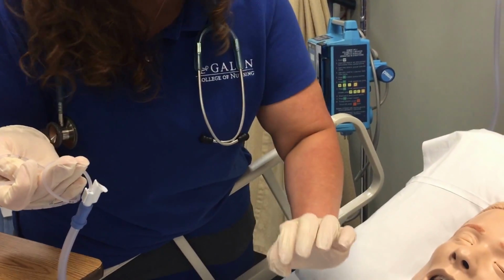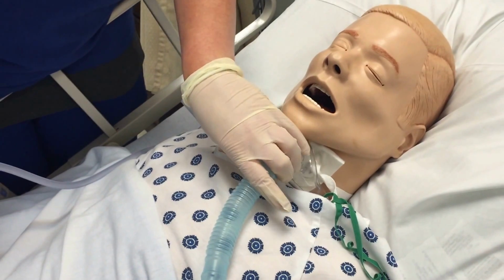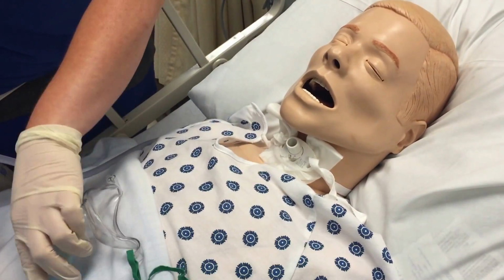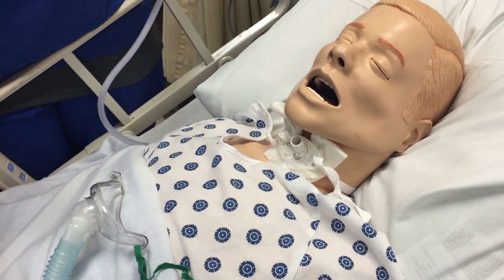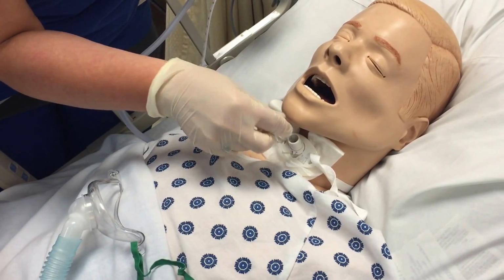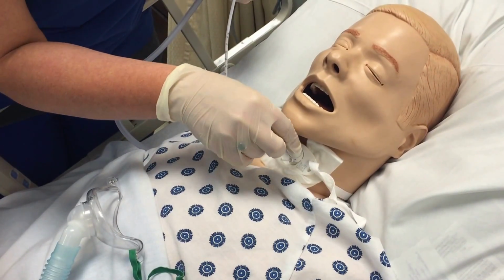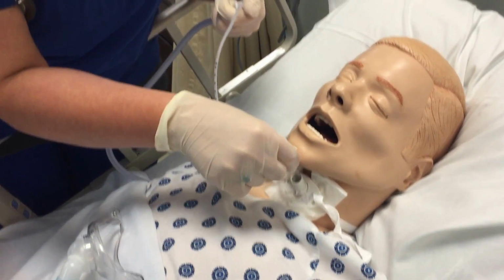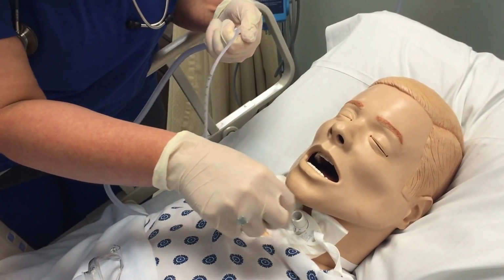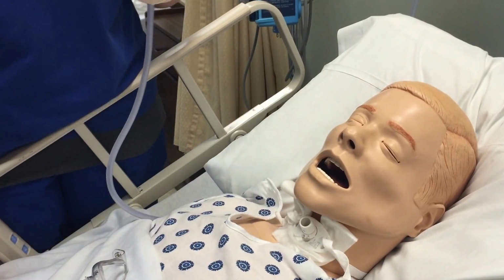All right, Miss Dan, we'll have you take some quick deep breaths for me. All right. Okay, just want to take this away for a little bit. All right. Okay, we're going to slowly take this in, trying not to hit the sides of the inner cannula until we cough. You see coughing. All right, cough, cough. All right, then intermittent suction and twirl on the way out. Not hitting like the chin or anything, and just keeping it sterile.